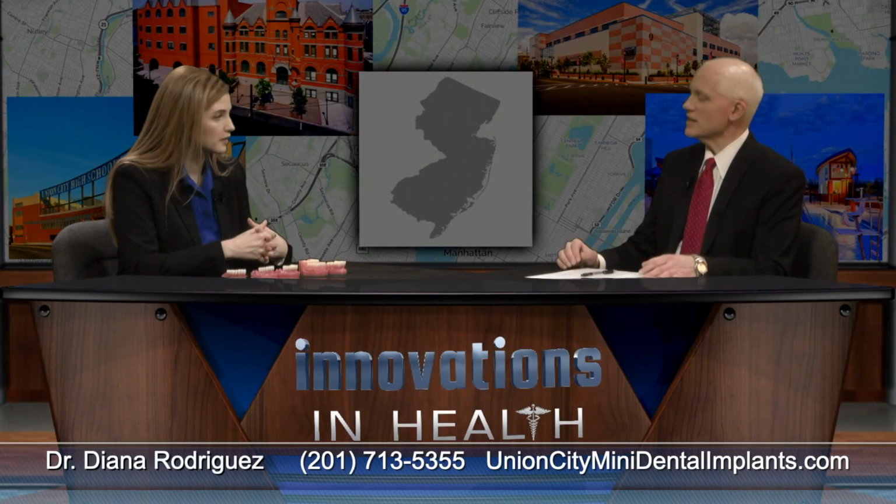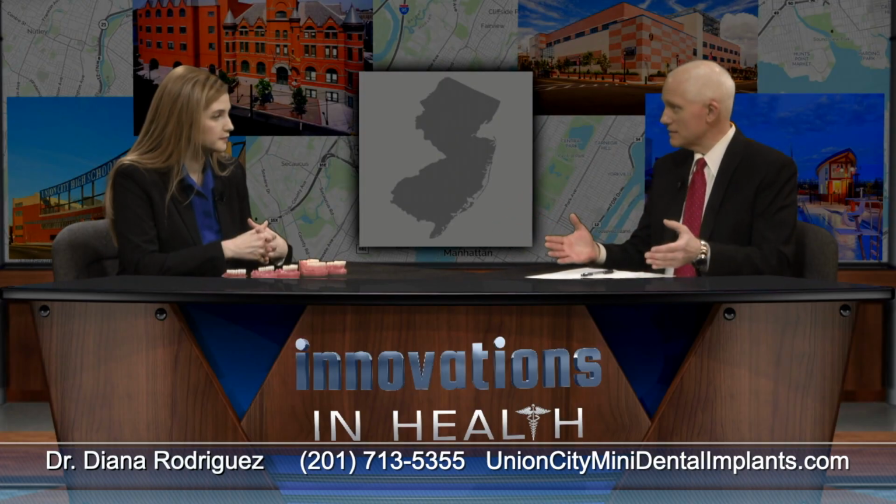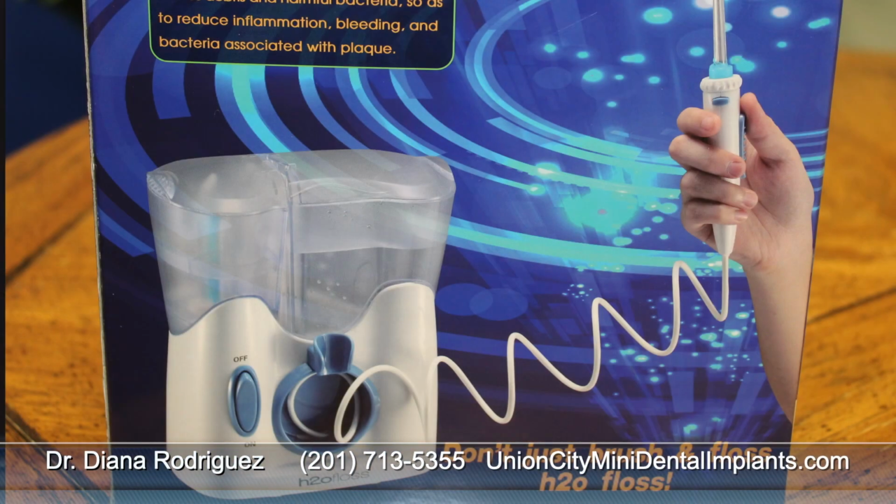So when this happens and you're able to put the mini dental implant into the patient's mouth, is there a longevity issue? And how would someone care for their mini dental implant? It's going to last them a very long time. It's hard to put a number on that, but I would say it is going to be a long time. In terms of caring for the implants and the prosthesis, it's normal brush, floss. We give each patient a water pick so they can keep everything very clean. We encourage that they come in on a routine basis, just like they would if they had natural dentition.